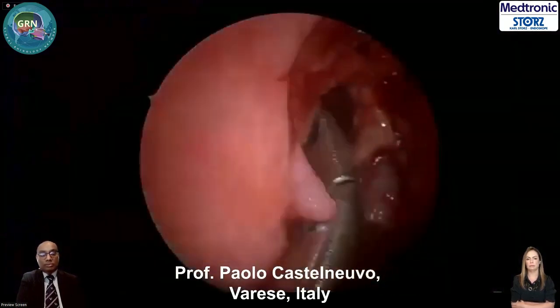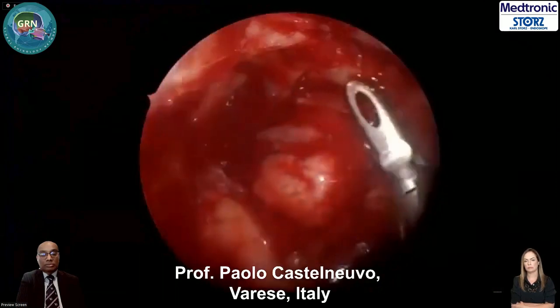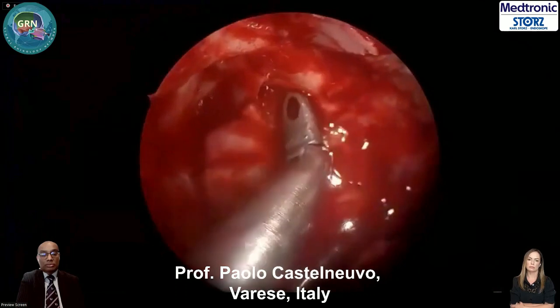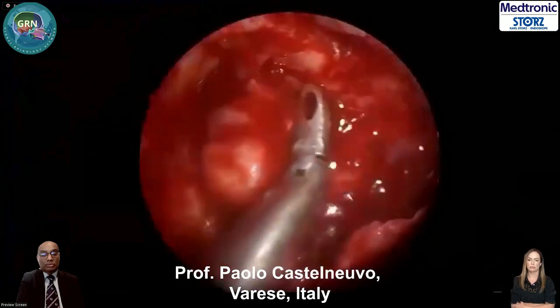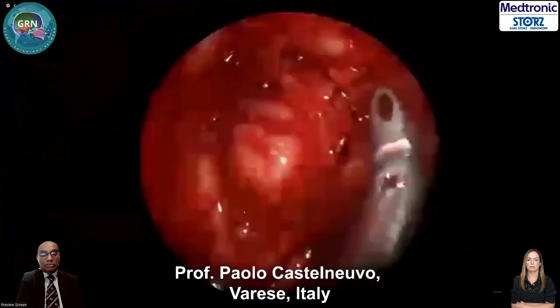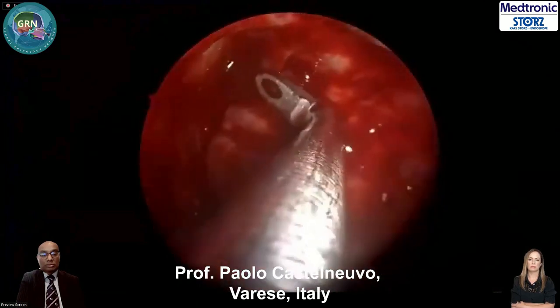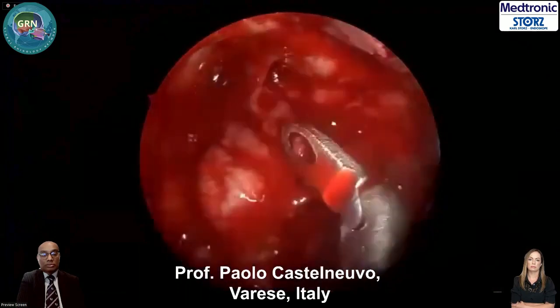Double curve instrument to enter and to make the resection. We don't need to resect the mucoperiosteum of all the sinus. We did that when we started this surgery 30 years ago, and then we had the coarctation of the sinus.